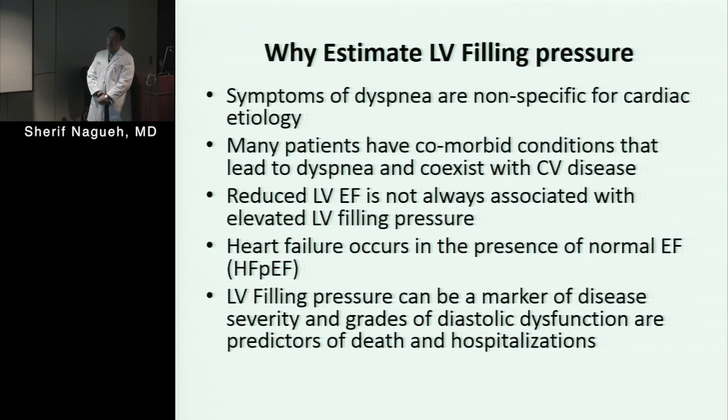Finally, when you look at filling pressures, they are a marker of disease severity, particularly if you assess them after the patient gets treatment. Do they improve? Do they stay the same? There are several studies. Some are epidemiologic, some are single center studies. This is how this whole field started, which have shown that the grades of diastolic dysfunction can predict outcome, particularly after treatment. And sometimes even natural history studies have been done where you take someone, say, with a grade 1 who becomes grade 2 or 3 for one reason or another, and you see that clinical events start going up.